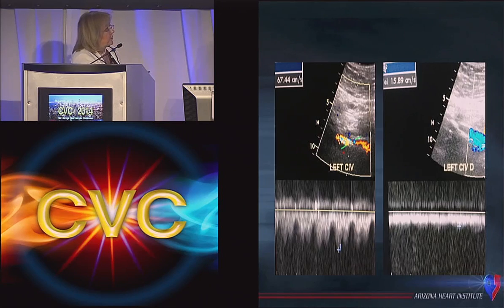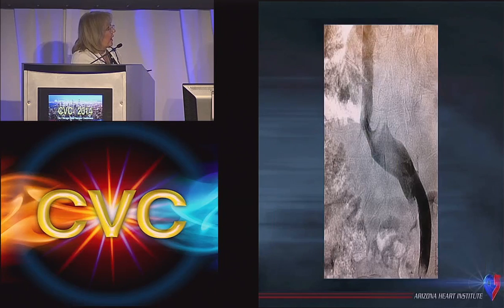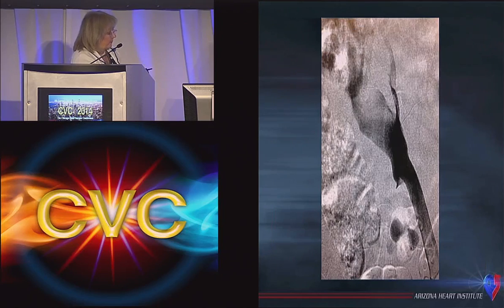And this patient presented with signs and symptoms of May-Thurner and a history of tibial DVT. You can see that she has non-phasic flow distal to the common iliac. And this is her imaging. She went to several places in California. She's from Northern California, and the imaging studies and the venogram all show that she had this very wide common iliac. In fact, it measured 33 millimeters.